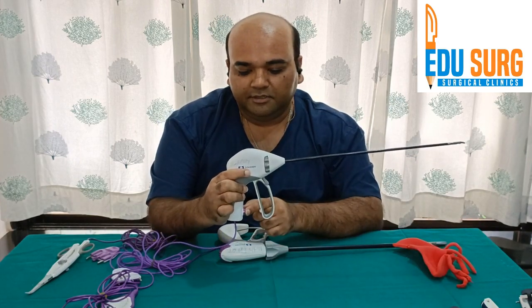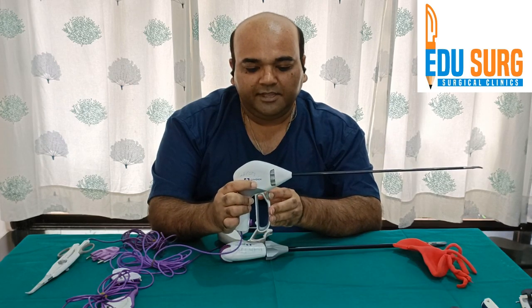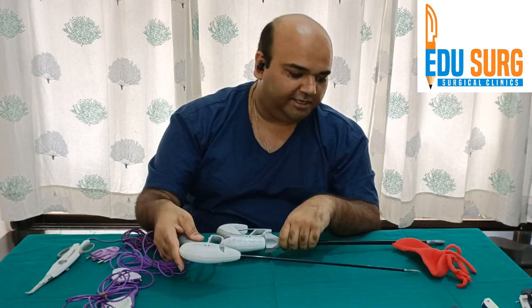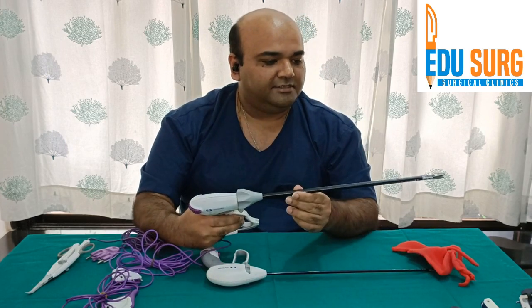So this is how LigaSure Maryland works: the holding jaw, the bipolar activating knob, the knife, and the rotation of the device for dissection. Similar mechanisms are present in LigaSure Atlas as well.